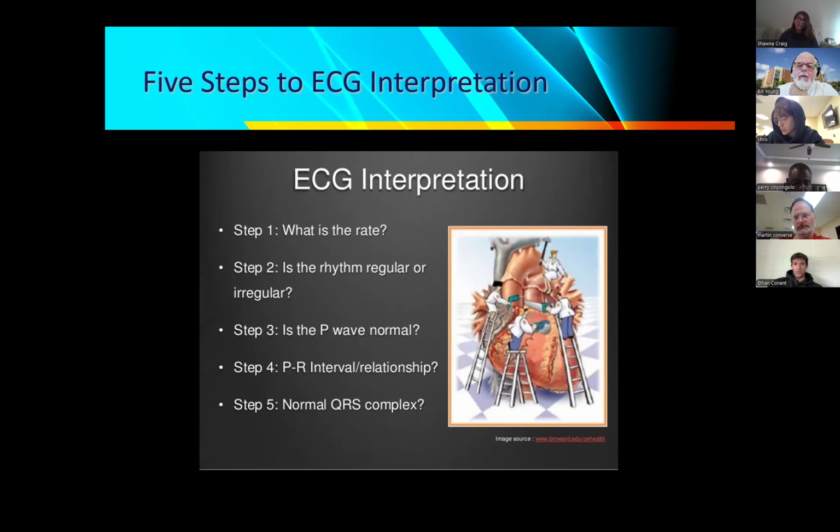Is it 3 little blocks? Yep. And how much time is that, Ethan, for 3 little blocks? 0.02. Nope. It's point... Now remember, each little block is 0.04 seconds. So if we have 3 of them, that means it's going to be 0.12 seconds. So that's what we're going to be looking for.